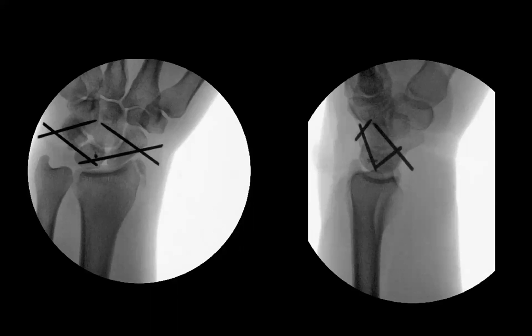And is there anything attached to the radial styloid fragment? I imagine brachioradialis is still attached there. Does anything attach to the radial portion of the radius? Any important ligaments? The radioscaphocapitate. Okay, and where does that attach on the radial styloid? I imagine it would attach where that radial styloid fracture may be. Well, how far from the tip of the radial styloid does the ligament attach? Because if that's the case, wouldn't you just fix that, not put all these other pins in? Honestly, not sure of the distance that it attaches at.